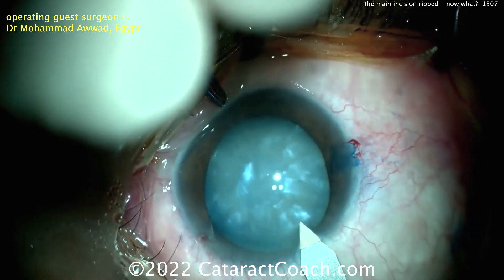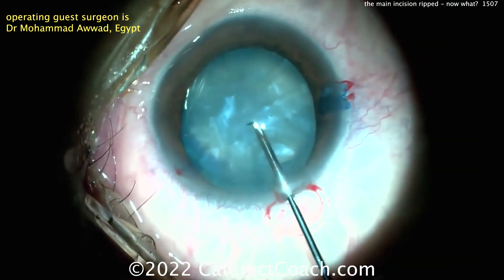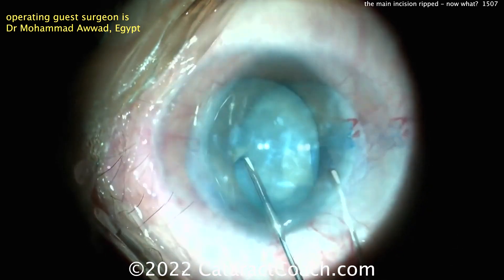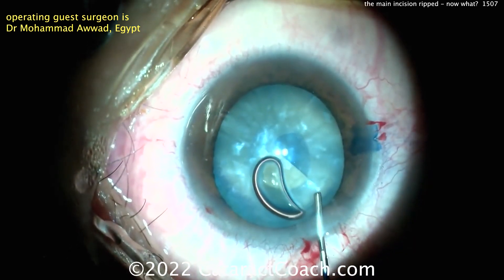Making the main incision here, it looks like a good incision — single plane, entering the eye. Looks pretty reasonable. Now starting the capsulorrhexis, you can see it's been stained with trypan blue dye. Obviously it's a nice real cataract, a white cataract here. Getting that rhexis complete — still the incision looks fine. No main issues there.